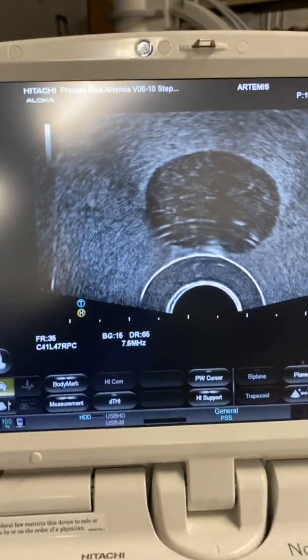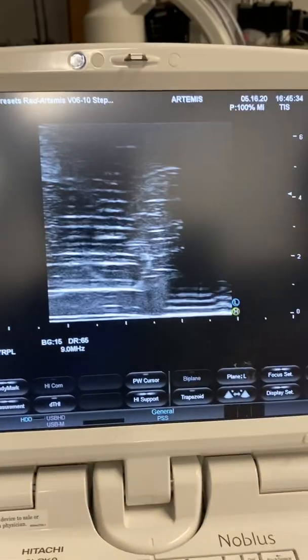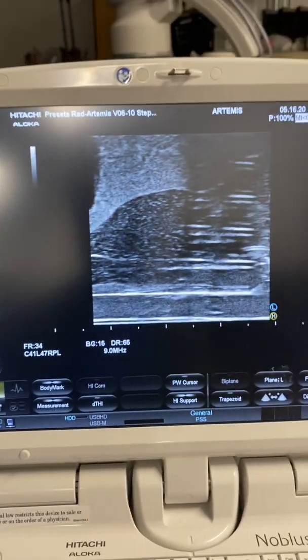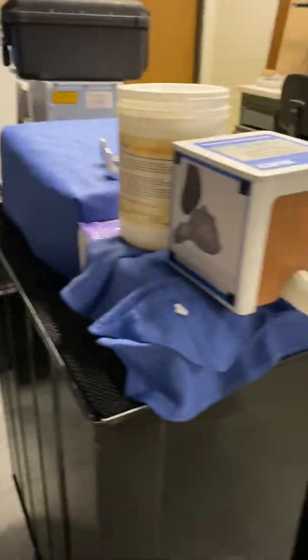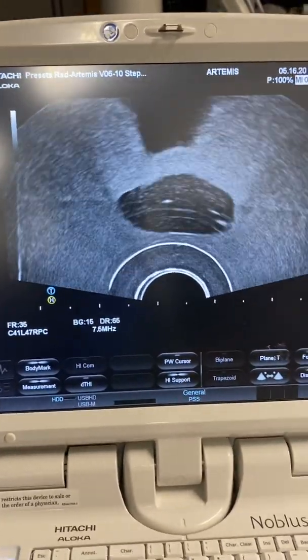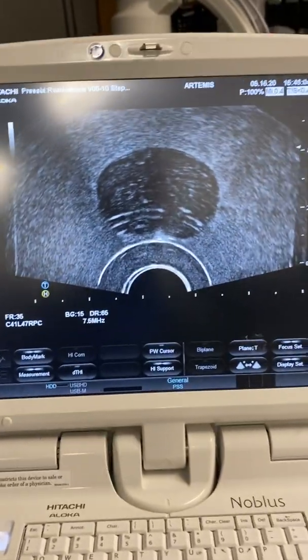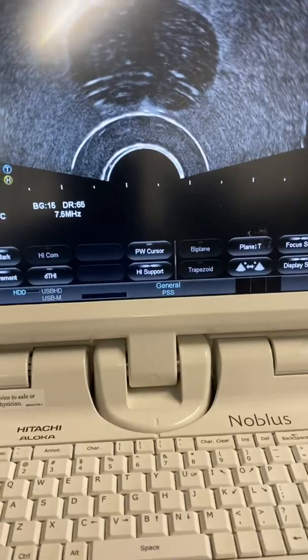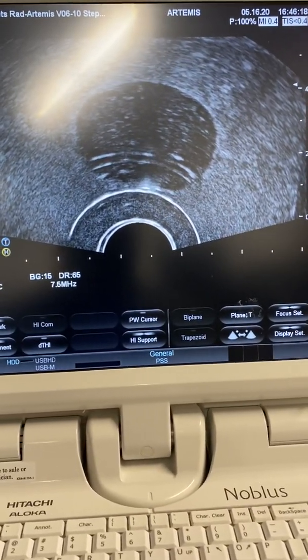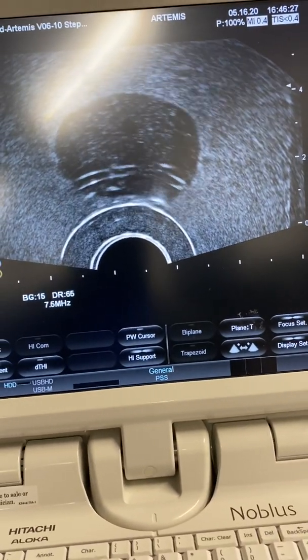The SpaceOAR rep is really the one guiding the urologist on how to move the needle, what to check, and injecting saline. You're basically switching the view for them and helping them step in and step out with either the stepper or the Artemis. When you switch to sagittal, you have to step in - push the probe into the patient's rectum to see the gland. When you step out, you're on axial. You have to move that crystal back under the needle. So: sagittal - step in; axial - step out. They'll do multiple checks on both views.